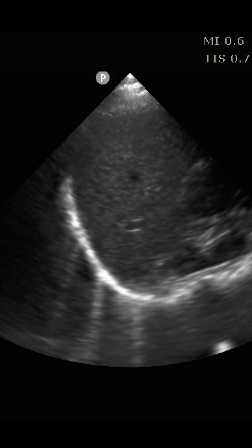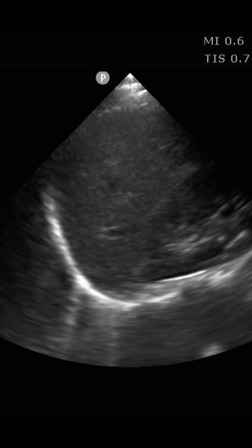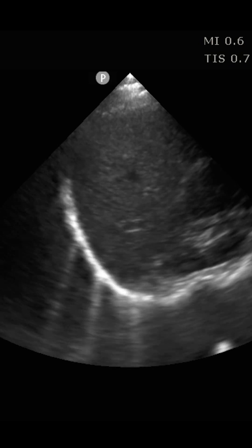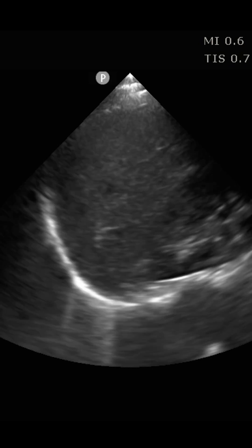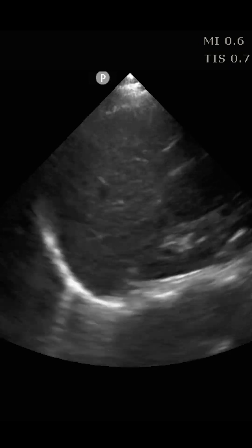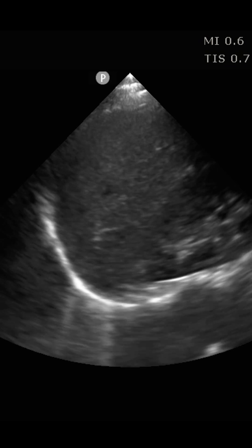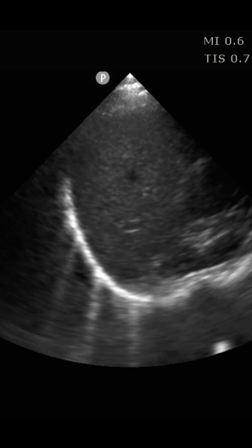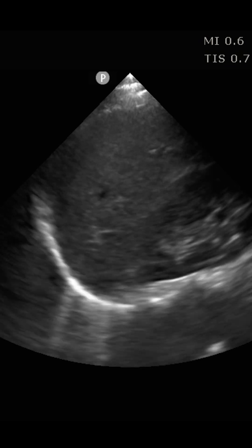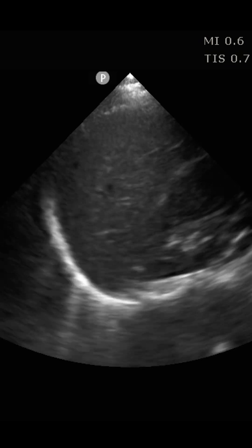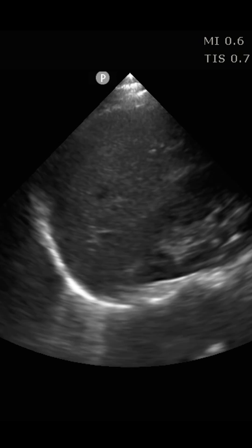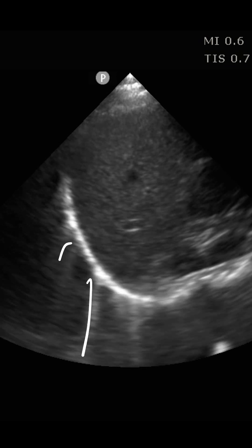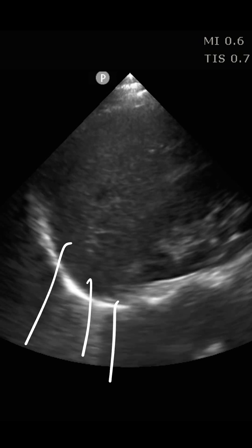When you have lungs that are inflated, you have the apposition of the visceral and parietal pleura. Then you can start seeing the artifacts created by the lung tissue just inside the lung. Those are the B lines that we see, emanating from the diaphragm and traveling to the deep part of the screen — right here, and right here, and right there.